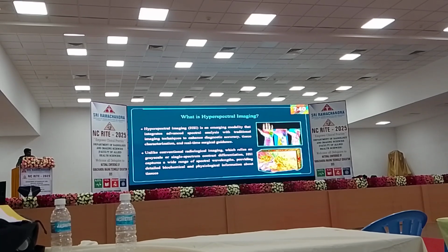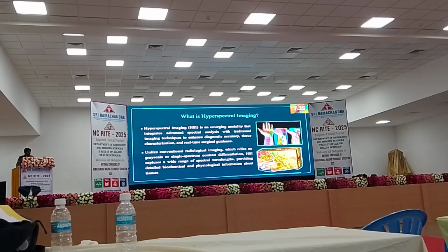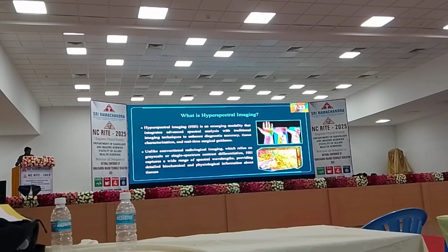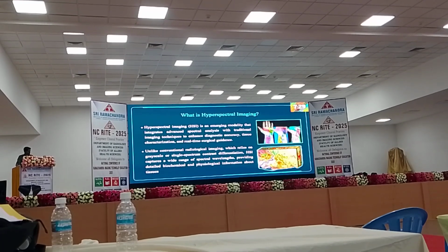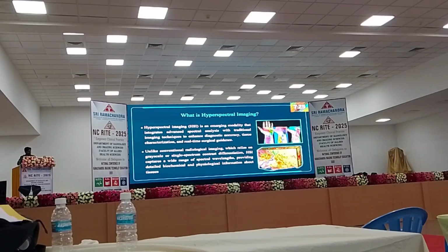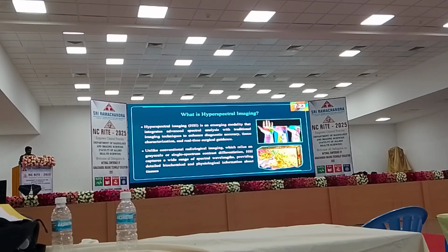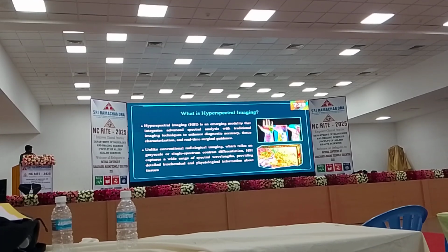You may ask, in the second image, why I put a geographical map to compare with an anatomical structure. You know what, the first hyperspectral imaging was only used for remote sensing, agriculture and food quality checks, to check whether the food quality is good or not, and to check the area, mineral quality and water content. Now it's transforming into medical imaging diagnostics.